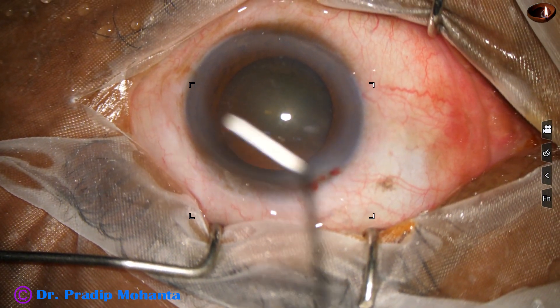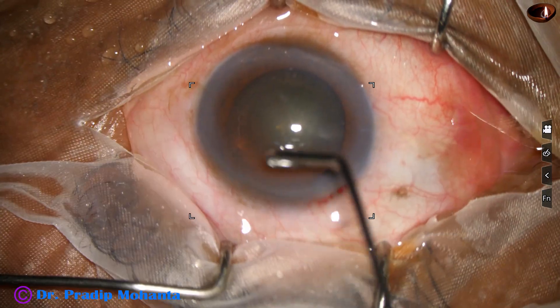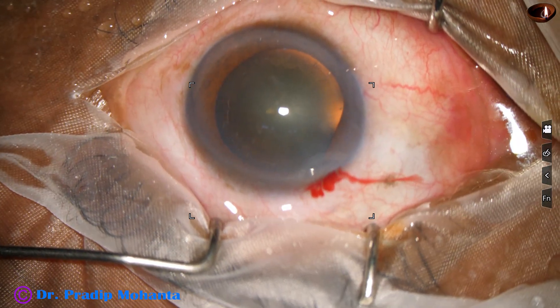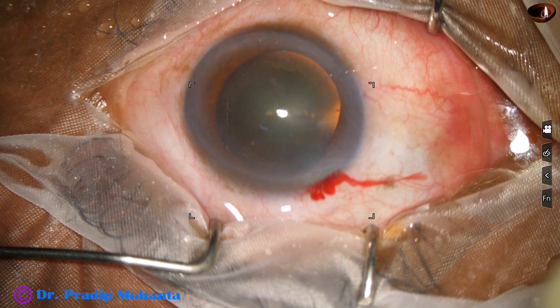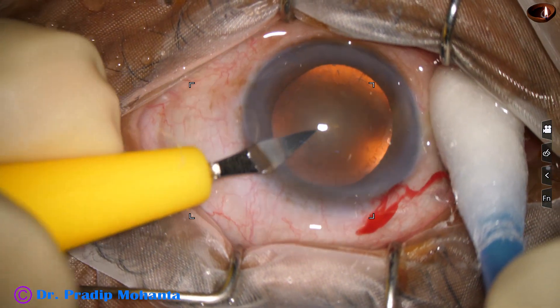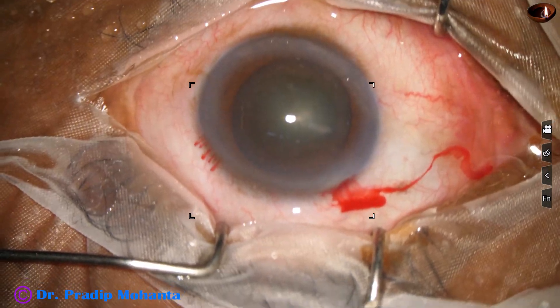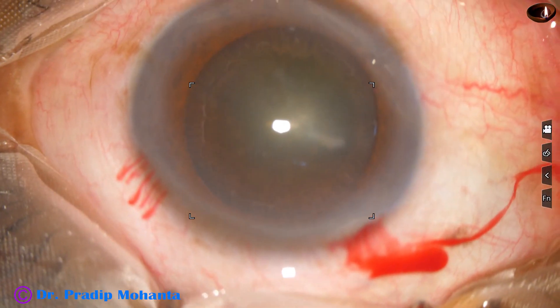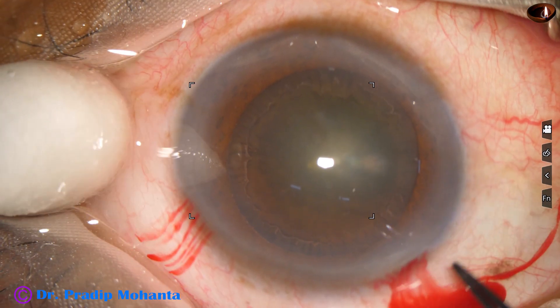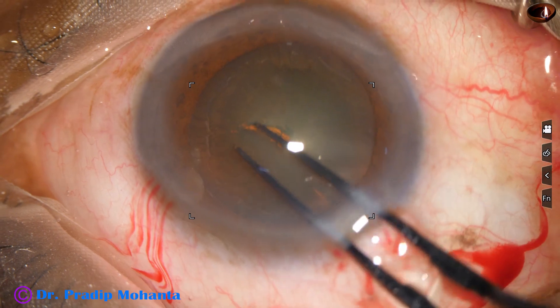The main incision has been placed on the posterior aspect of the limbus. You can see little oozing of blood, and this is good. Healing is better if you include some capillaries in your incision. A side port is made on the left side of the main incision, about 3 o'clock hours away. This side port is about 1.6 to 1.8 millimeter. If the side port is a little larger but placed 90 degrees away from the main incision, the induced astigmatism will be neutralized to some extent by the side port.